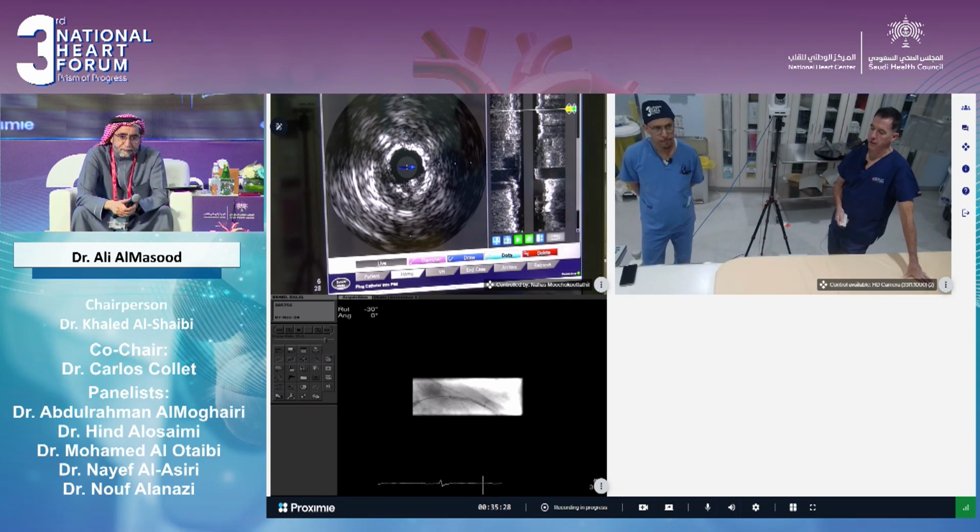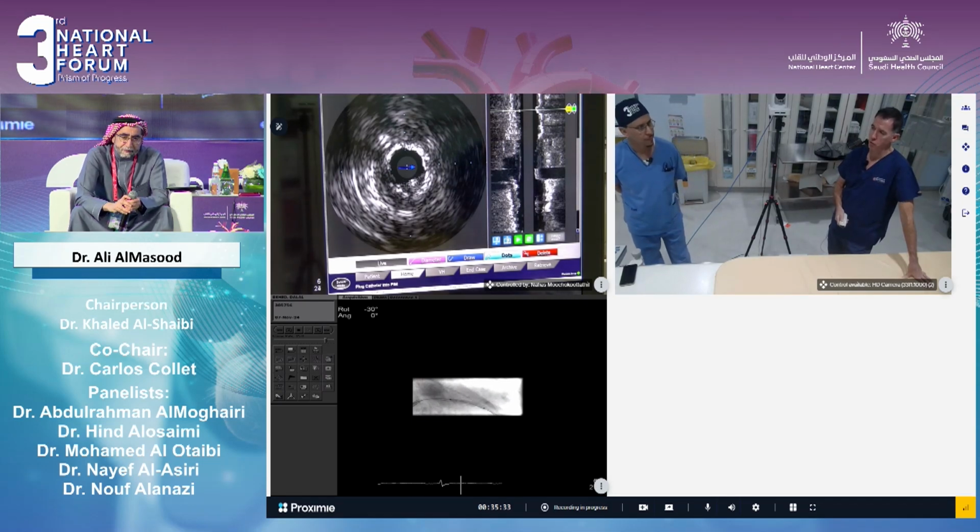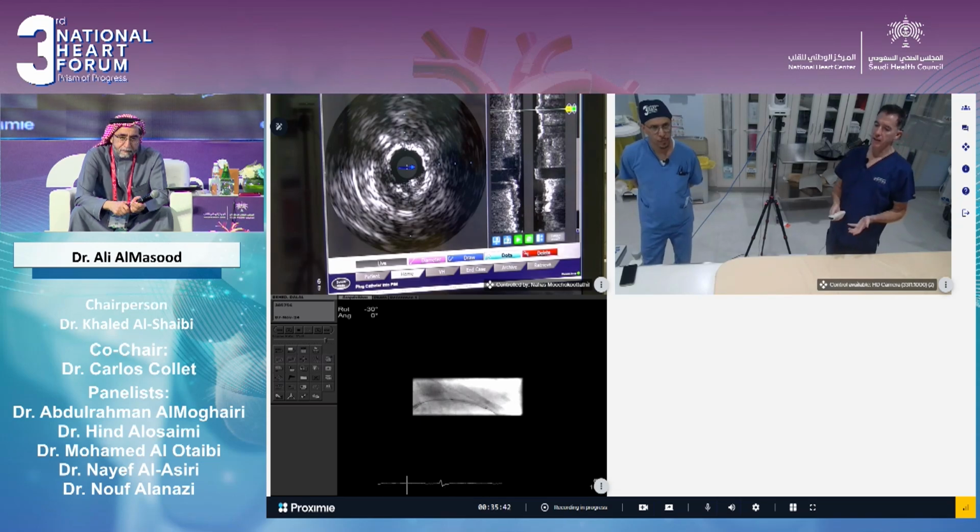It was very, very focal on the CT scan and on the IVUS, and we felt that it was a Volcano IVUS, which isn't the most deliverable. We gave the lesion a squeeze with a 2 balloon, and the Volcano IVUS was able to go. So we think it signified tight disease.